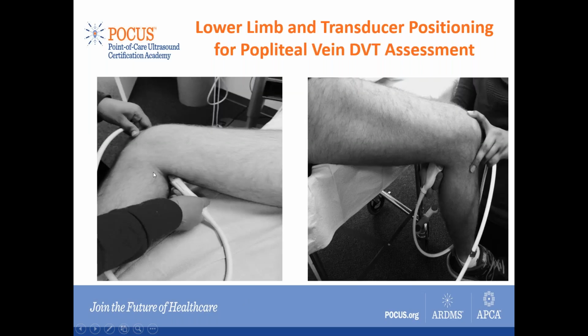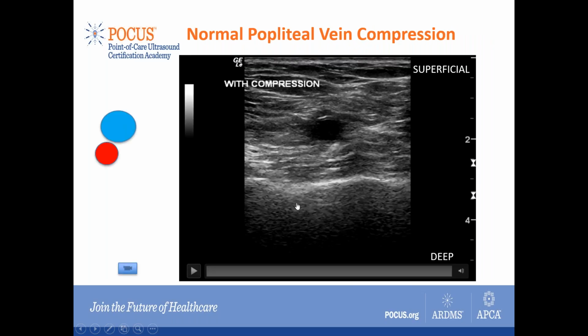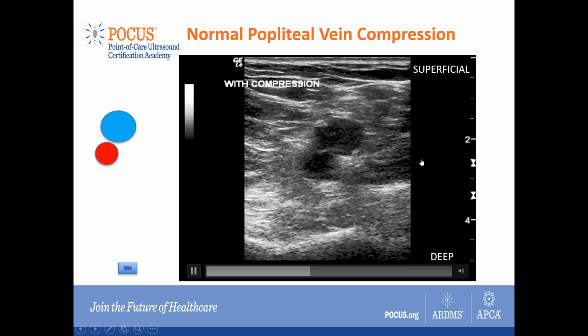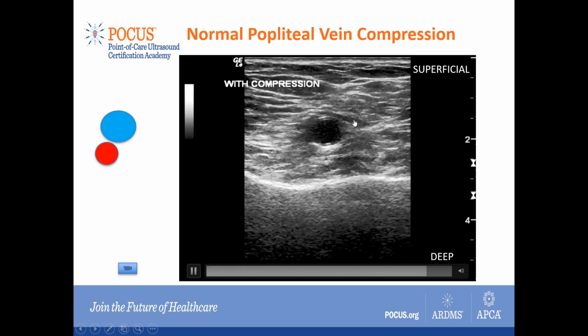And here you can see the test being performed in the popliteal region, putting the transducer there, and then we can even have the patient sitting on the edge of the bed. At times you have difficulty, so we can even have the patient stand on the floor to distend the popliteal veins so they become more prominent. Here's another video showing what you would expect in normal conditions in the popliteal region. Here you see the popliteal vein, and this is the artery, and clearly it's fully compressible.